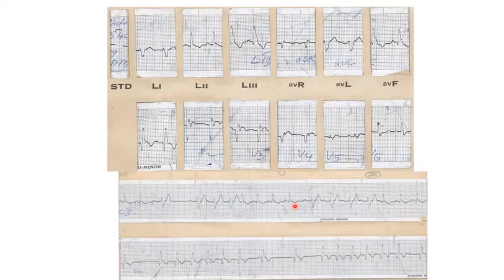The intermittent. Oh, you're right. Branch block. Which one? Sir, in lead two, we are seeing the S is slurred. So, if you try to interpret the axis of these QRS complexes, what would it be? Left axis, sir. It may be left axis. So anterior hemiblock. Yeah, the left. This is left anterior hemiblock.